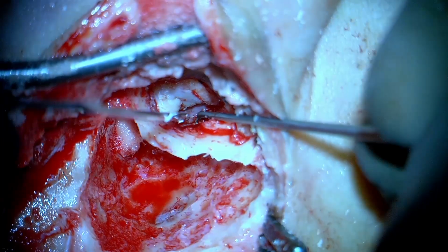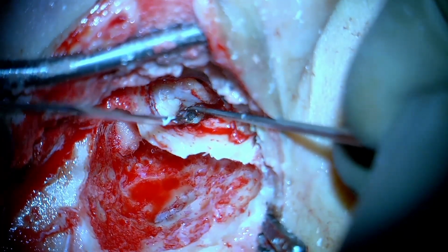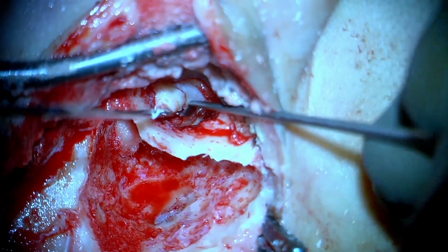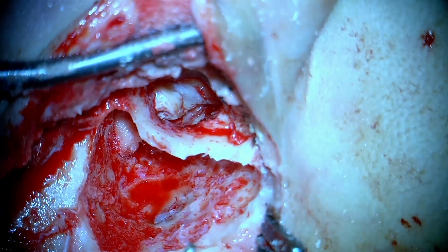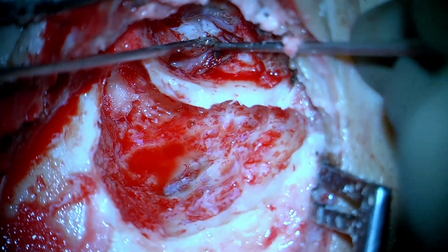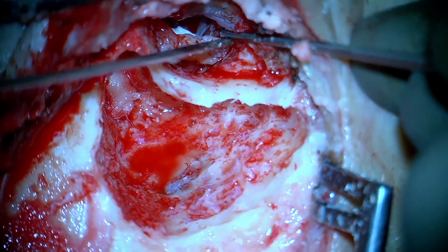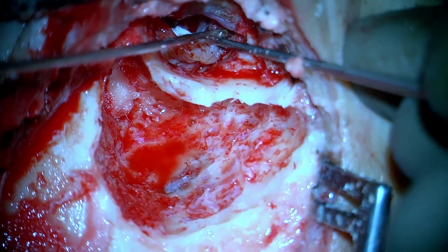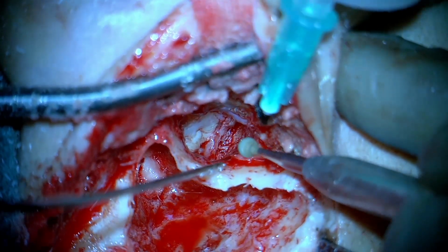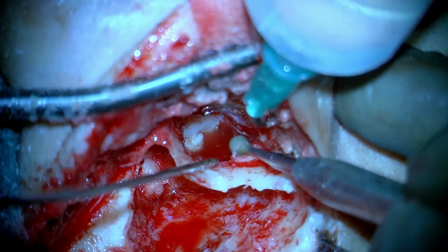You see, this is the cholesteatoma, or the thickened skin of the external canal wall that you see. And now we are carefully elevating the entire TM flap from the middle ear to examine also the ossicular status in this patient, because this patient already has very minimal hearing loss, you would try to preserve the ossicles until it's absolutely necessary to sacrifice them.